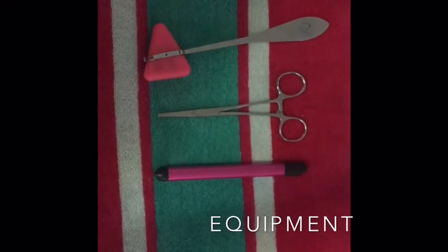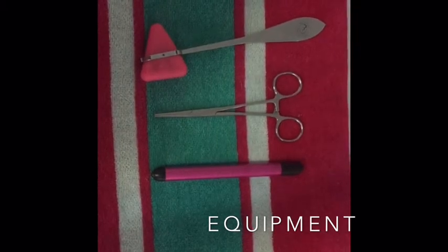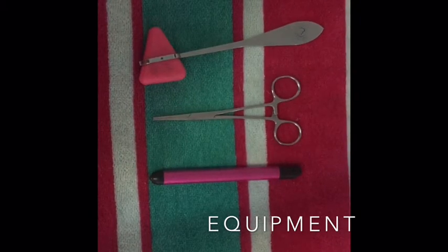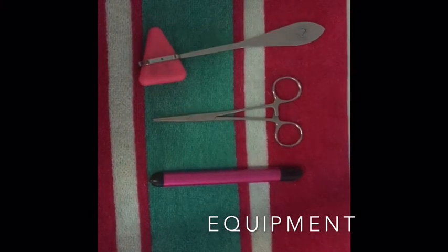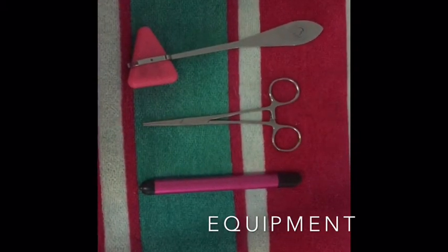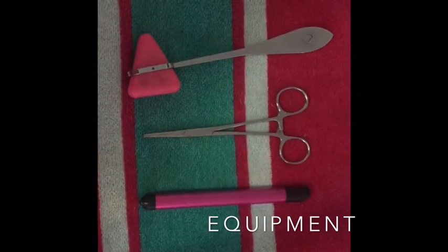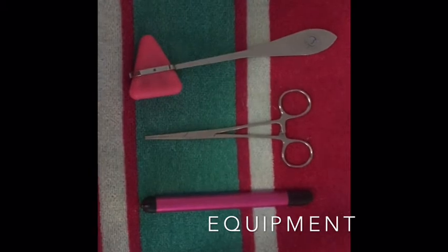The equipment necessary to perform the neurologic examination includes a pen light, a percussion hammer, and a pair of hemostatic forceps. The neurologic examination is a series of observations and tests done to answer the following questions: Is a lesion in the nervous system present? Where is the lesion located? How severe is the lesion? And is the disease worsening, improving, or staying the same?